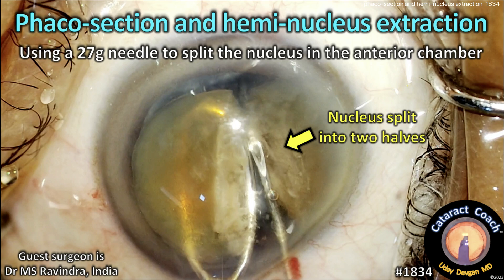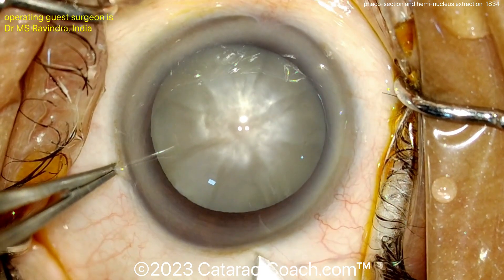cataractcoach.com — phaco section and hemi-nucleus extraction using a 27-gauge needle to split the nucleus in the anterior chamber. Check it out.